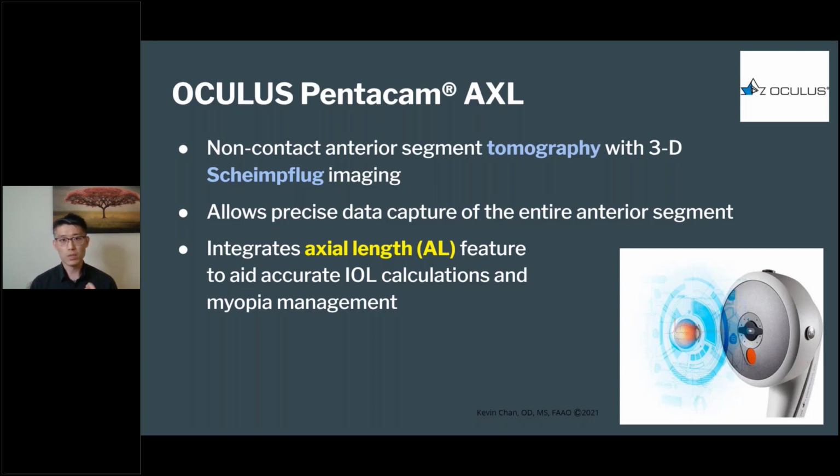To understand this equipment, we need to understand the basics first. This Pentacam AXL is a non-contact anterior segment tomography with 3D Scheimpflug imaging, and this allows precise data capture for the entire segment in just a matter of seconds.